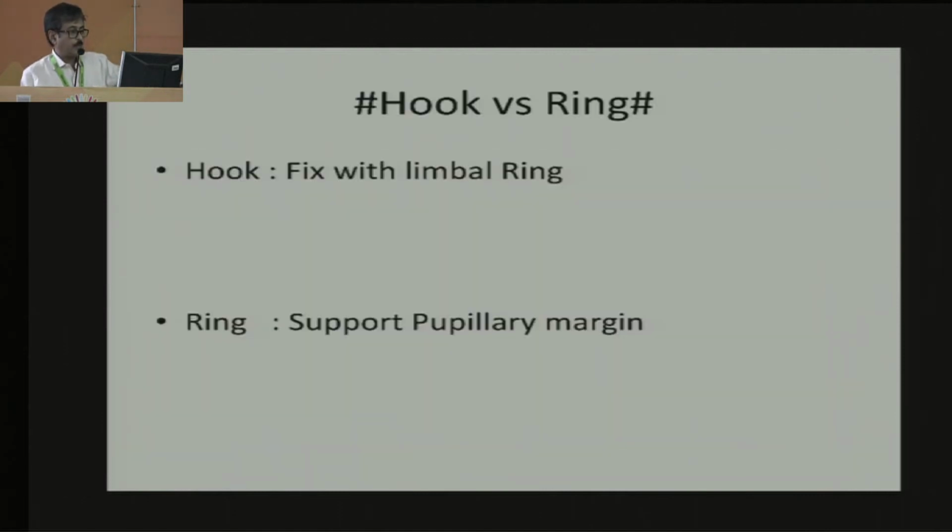But if it is an elastic pupil, and your rhexis size is larger than the pupil size, the fluidics can hit the iris and the pupil will come down within a minute to a 2 millimeter pupil. So this is very important. For IFIS, you have to do a smaller rhexis, smaller than the pupil size. This is the key word when treating your small pupil.